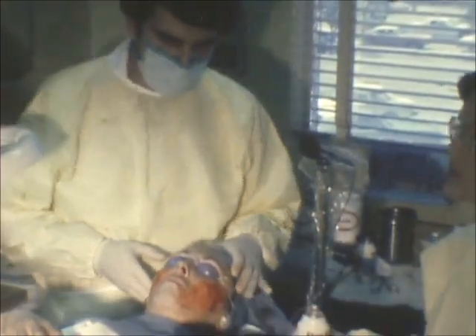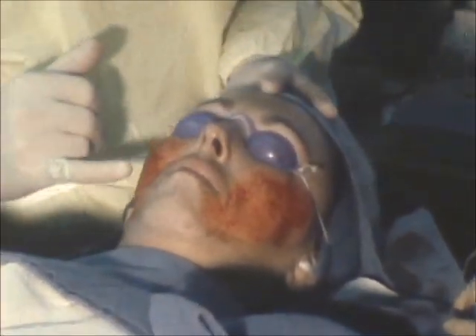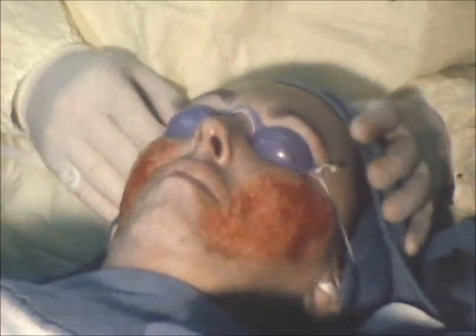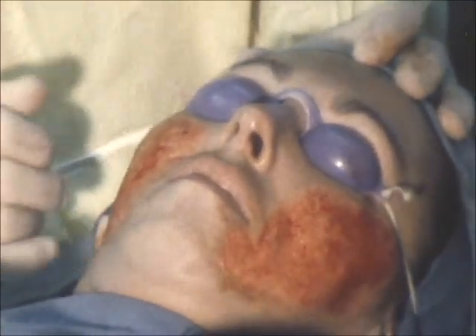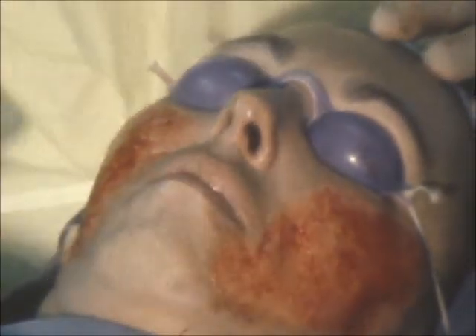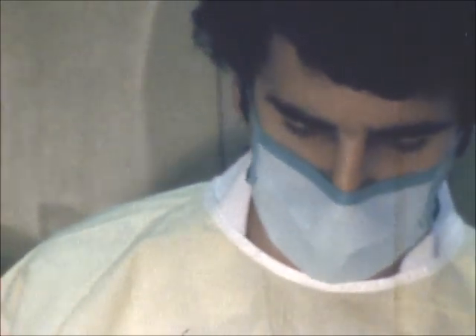This is how the face appears after the first stage of the dermabrasion. There's a slight oozing of the serum — this clear yellow fluid on both sides. We can generally see that the abrasion has been complete, but we'll check now for skip areas and go over very lightly the entire area so that we'll get a nice smooth appearance. We'll now return to the right side and do that, and then go over the left side.